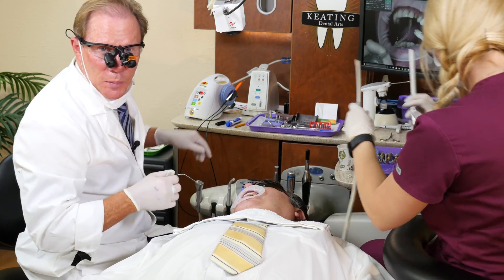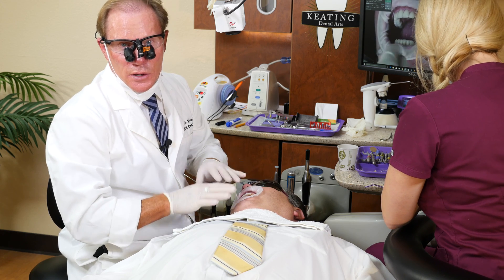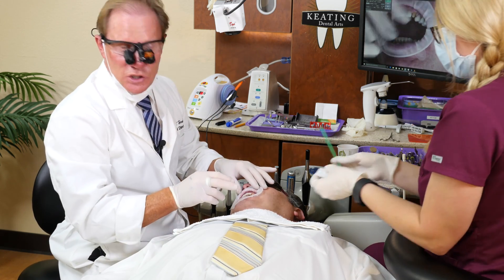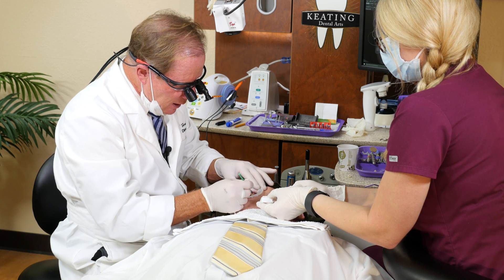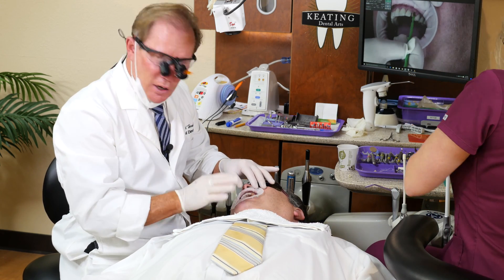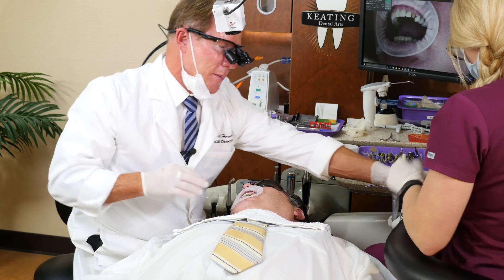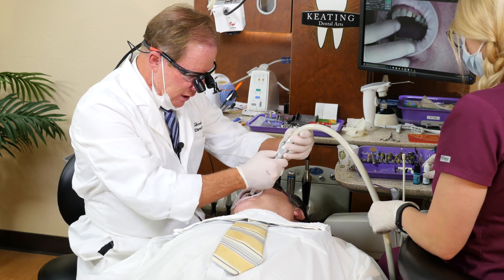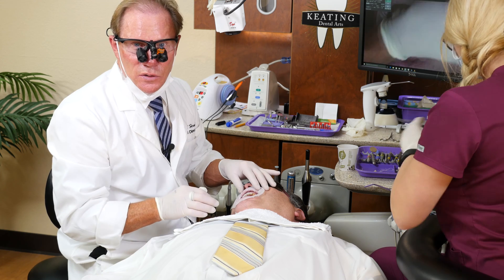Before I put my primer, I'm going to put a desensitizing agent. This is a glutaraldehyde-water HEMA solution — there are several on the market, but the one I prefer is called MicroPrime G from Danville Engineering. It actually increases bond strength — great studies on that — and it decreases sensitivity. Anytime I do a total etch, whether it be a crown like today or a direct composite, after I etch I don't desiccate — just remove excess moisture, put a layer of MicroPrime G on, let it sit 10–15 seconds, then suction the excess moisture. Our goal with total etch is to bond to a non-desiccated tooth — not wet, not dry.